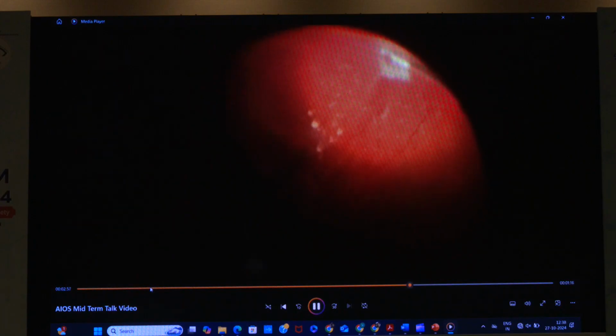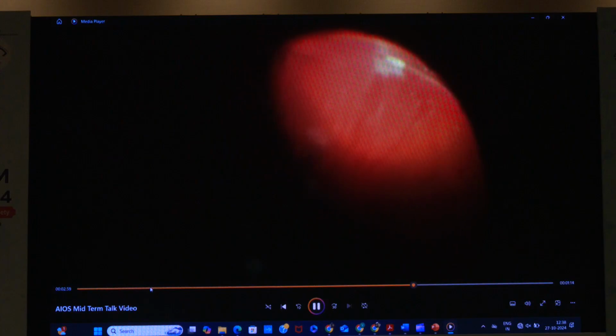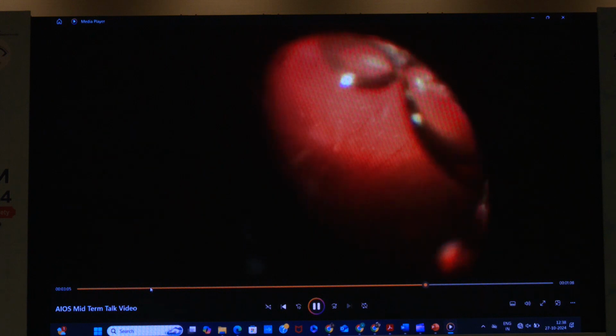Okay. One more thing, while you're going around, you have to mark the break. This is diathermy. I have marked the break. So in this surgery, I didn't get any iatrogenic breaks. But as soon as you get the breaks, keep marking them with your diathermy. Otherwise, you might forget. And after FG, you can't visualize.